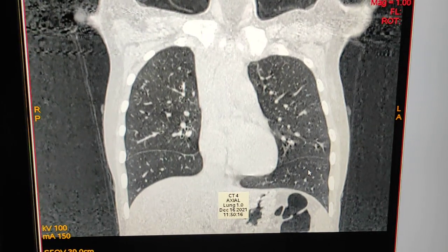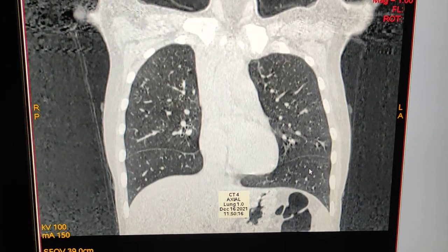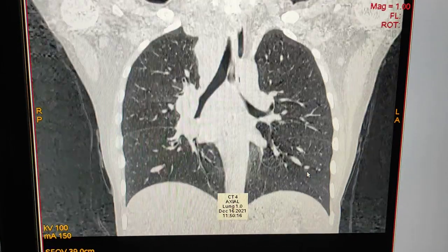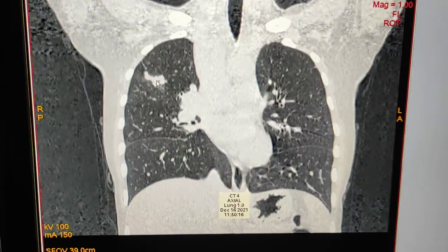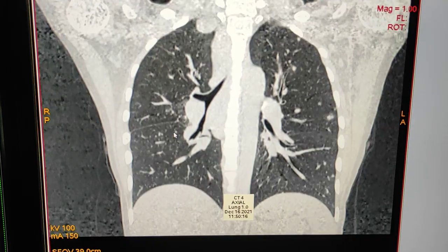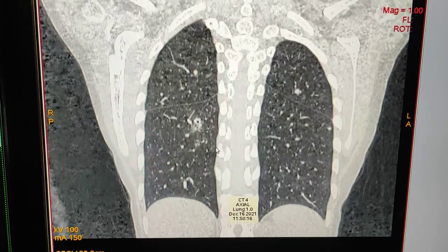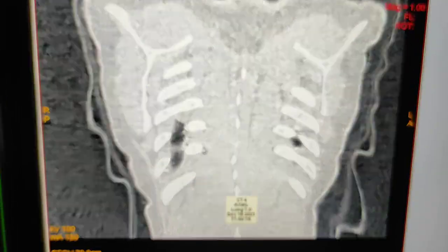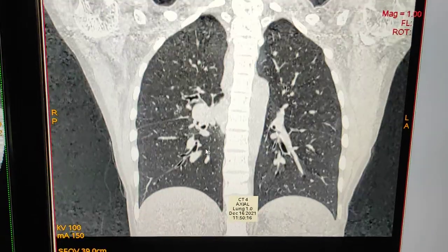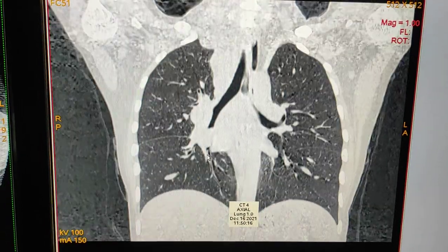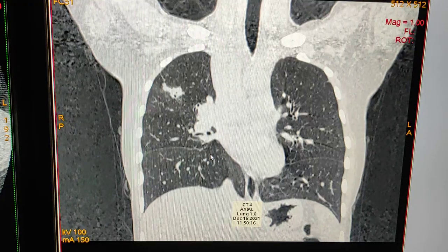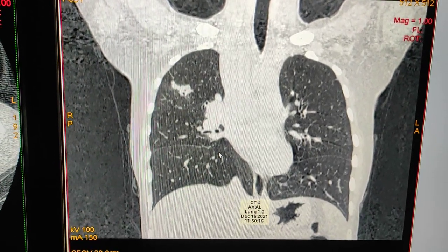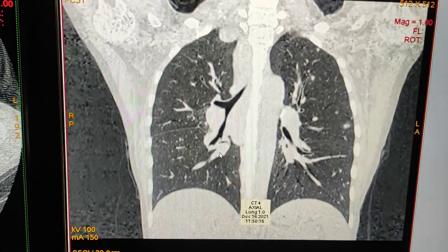This is the cavitary lesion on the coronal view. This is also a cavitary lesion. This is how Koch's lesion looks on HRCT of the lungs.